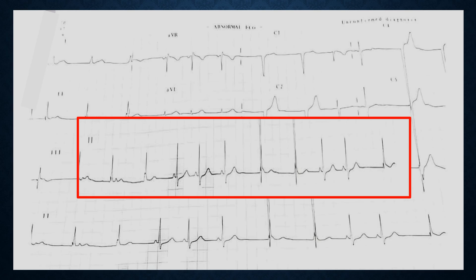Let us look at the long lead 2. Here we can see some funny looking complexes. We need to see what's happening, as there are two different types of morphologies in the QRS being seen — one here and the other here. Looking at the P waves, at some places the P wave is preceding the QRS complexes, and in other places we can't see a P wave.